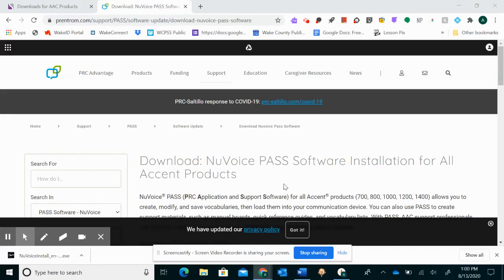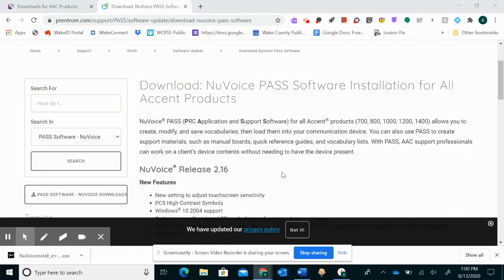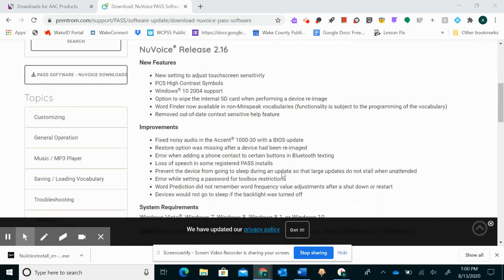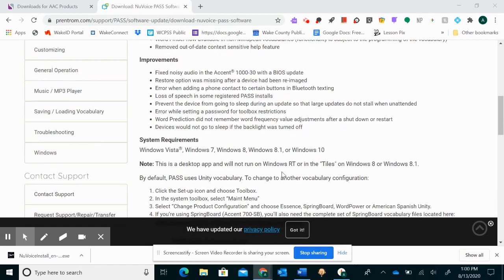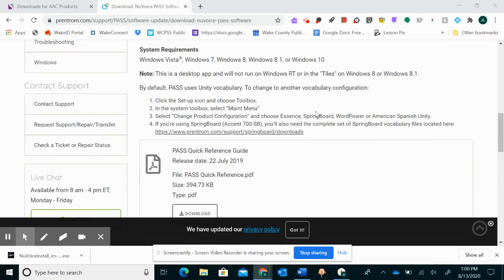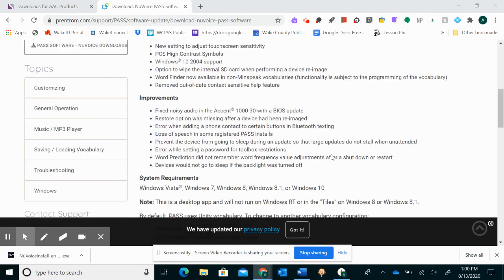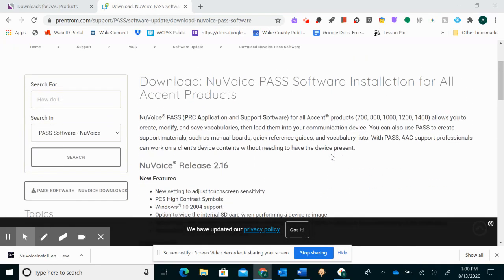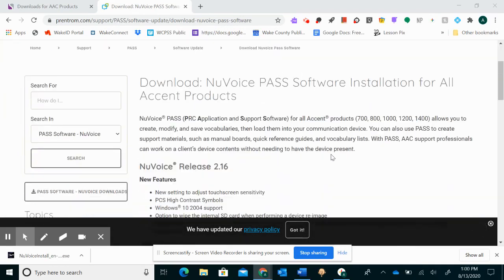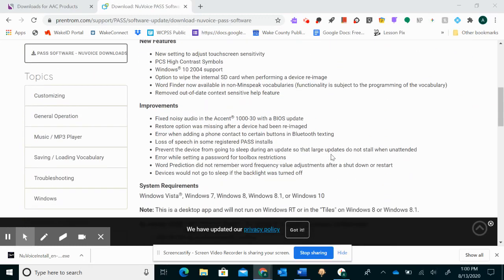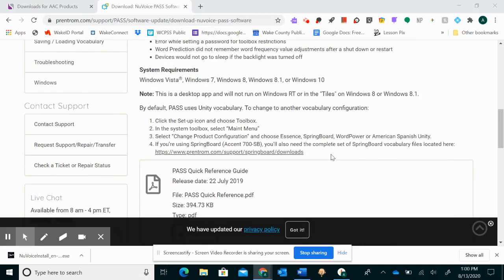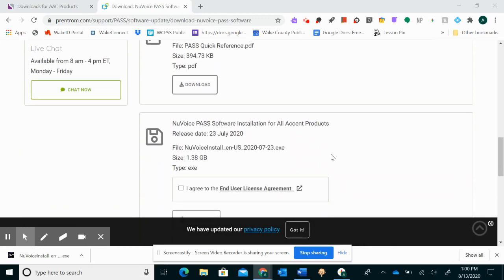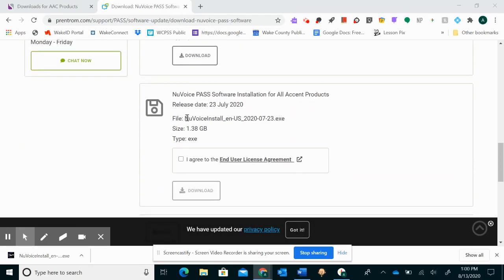We're going over how to download the PaaS software and how to set it up and talk about the writing with icons capability. So this is the link that I'll send you. This takes you to the PRC's website. We're going to scroll down and go to the second option which is new voice PaaS software installation for all accent products.